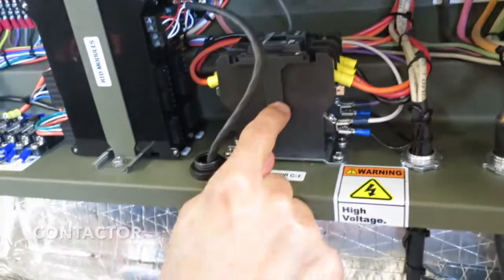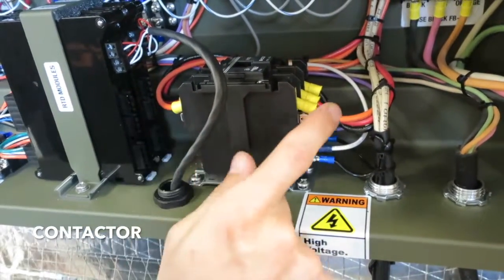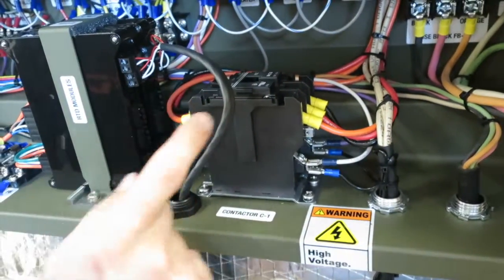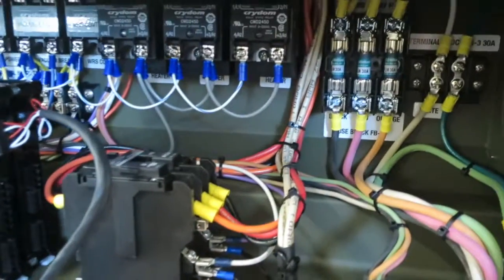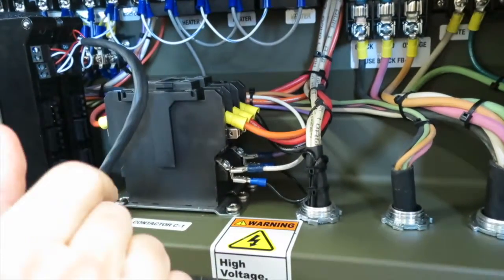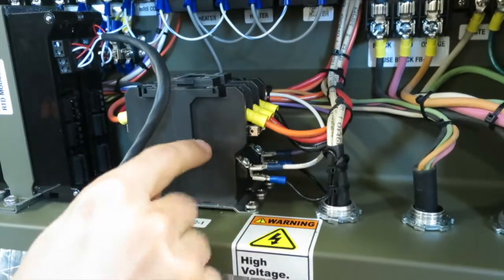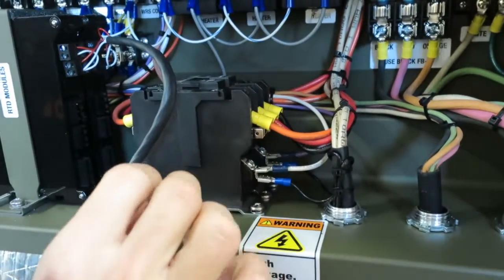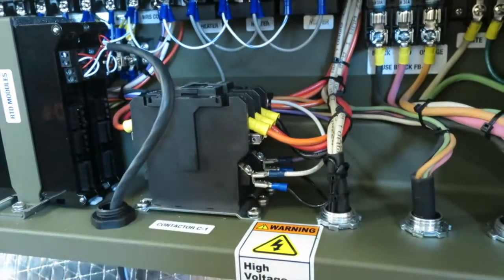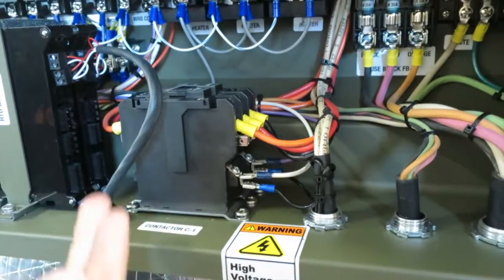Alright, right here we have the contactor. The label says contactor C1. On the right side, I have incoming power. And on the left side, I have power that's going to the rest of the unit. Right here, this white and purple wire actually go to the on and off switch. So when you turn that switch on, that is what is mechanically moving this contactor and supplying power to the sterilizer. So that's the contactor. Whenever you hear that click when you first turn the sterilizer on, that's this contactor moving.